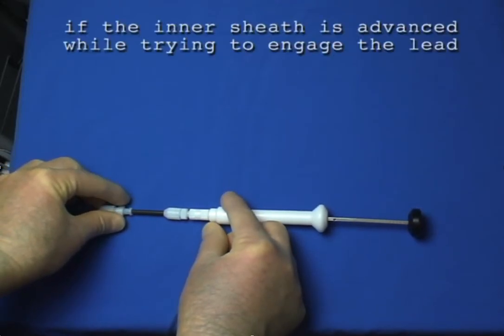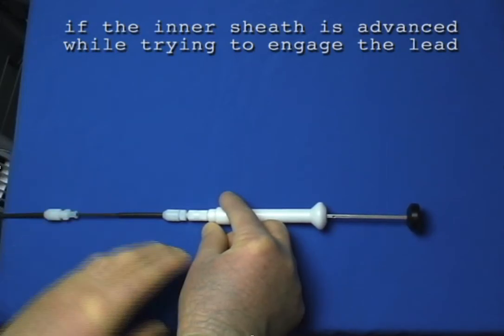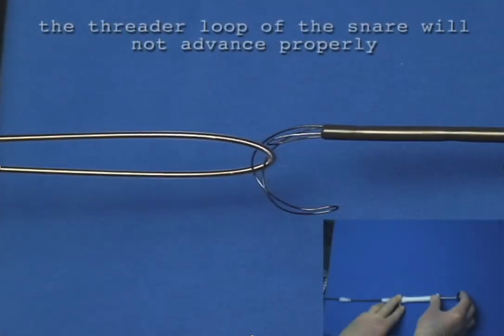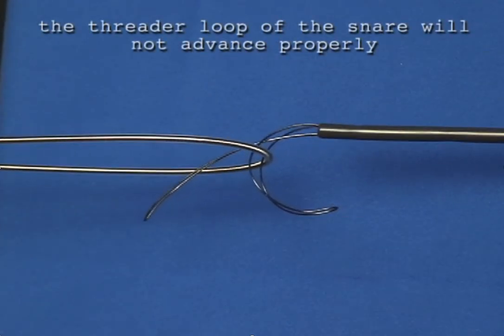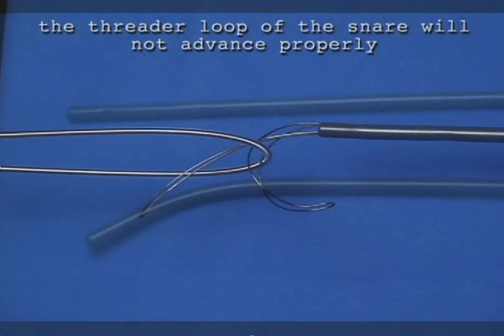And one of the mistakes that I made was that if this inner sheath is advanced a little bit while you're trying to snare, before you've actually locked it in, you get into trouble. So this is the first mistake I made. I had the inner sheath up a little bit where it's supposed to be back, and then when I advanced the threader loop, it would always go in the wrong place. And I can tell you there were some blue words spoken because I couldn't snare the lead, and I had no idea that the reason this threader loop was not working properly was because I had inadvertently slid the inner sheath up, which prevented this threader loop from going where it needs to go.